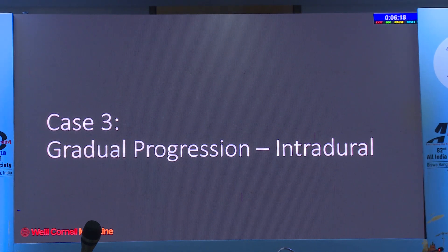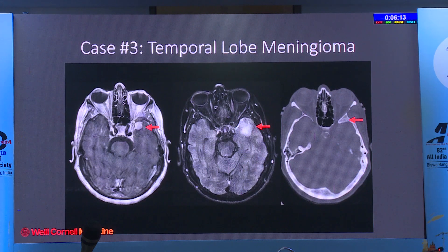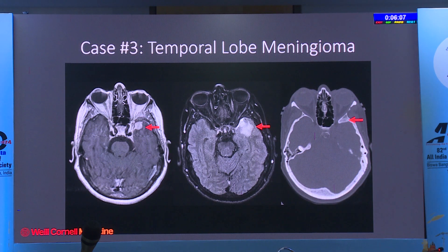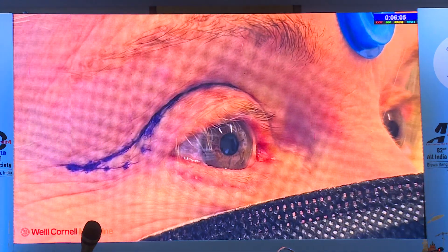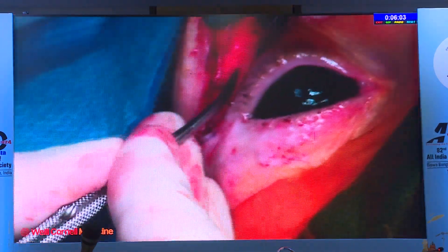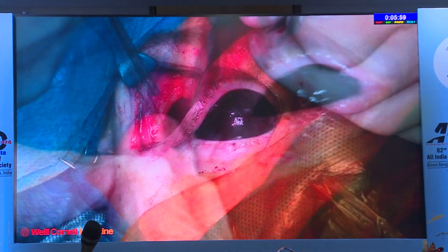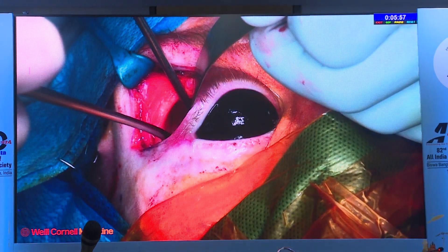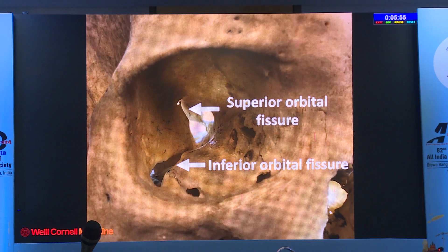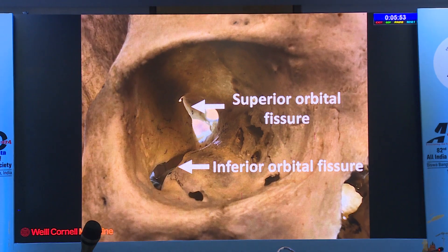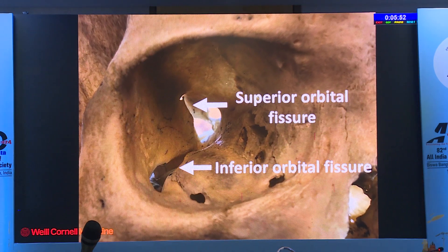Most recently we've progressed to bigger intradural cases—intradural meningiomas, intradural gliomas. The approach is the same. Here's an example of a temporal lobe meningioma right at the skull base requiring significant craniotomy and retraction, approached just like a lateral wall decompression: subperiosteal dissection, exposing superior and inferior orbital fissures, drilling the greater wing of sphenoid, and approaching laterally.